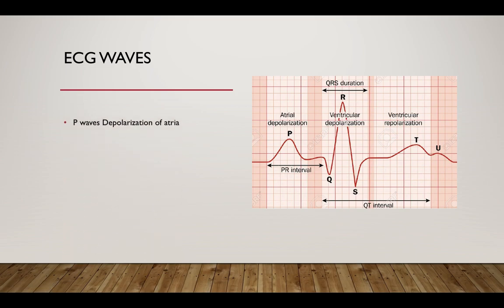Yes. So if we see this P wave, it shows something. I use the word depolarization. It changes the action potential in the upper chambers of the heart. It's actually a wave of depolarization. It depolarizes the atria to make them contract.